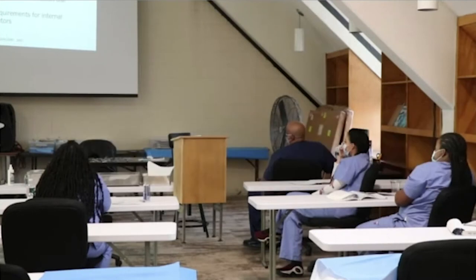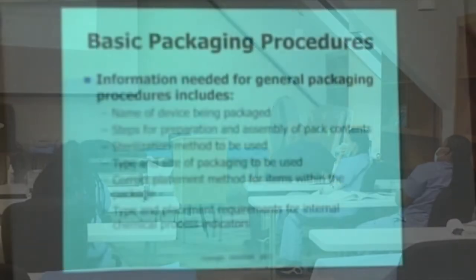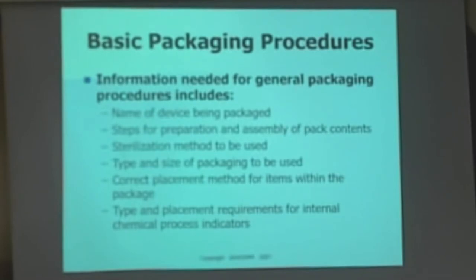Here we go. What's the device that we're packaging? Is it a shaver? Is it a whole tray? The steps for preparation, you guys walk me right through it step by step. We made sure that we had, whether we were going to pack it, wrap it, or box it, true? This is real important, and you guys tell me why. Excellent. And the reason why that is important, can anybody elaborate?